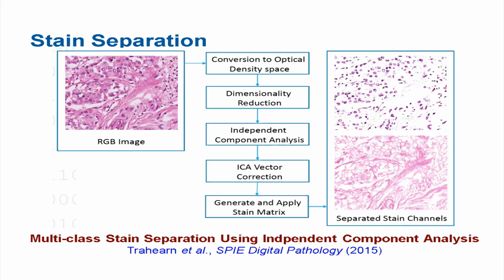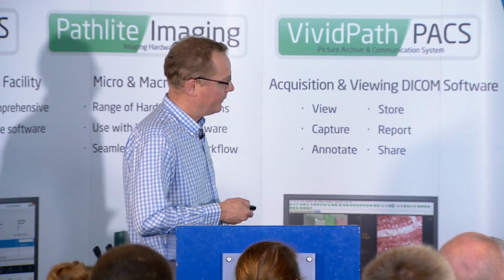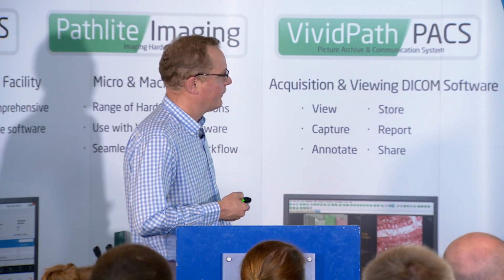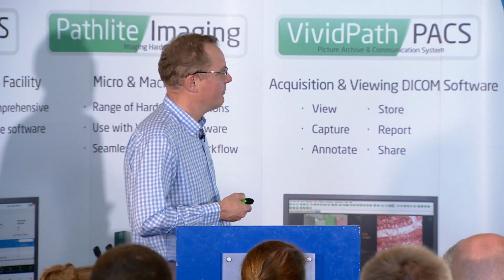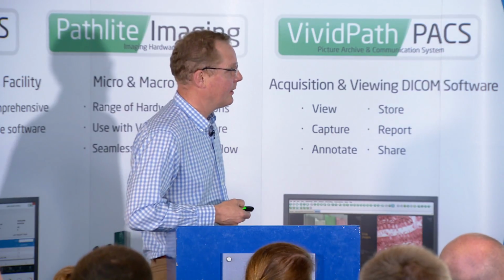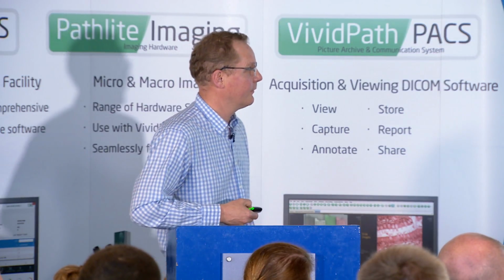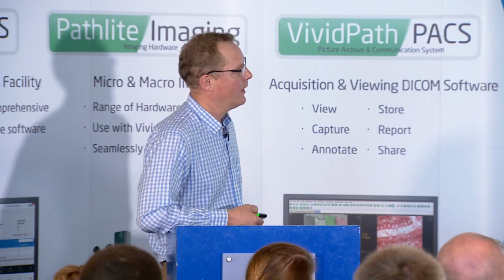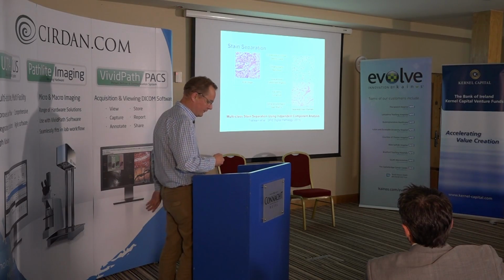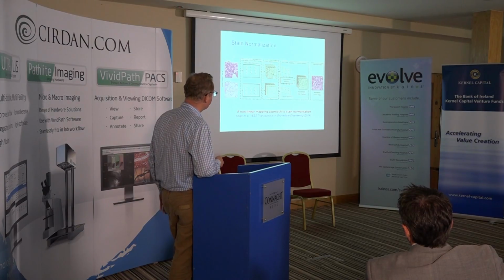And we do this by separating out the various aspects of the stain. In this case, it's an H&E stain. So what we've done here is we've taken one section, that's its H&E stain. We've bleached it. Then we stained it with hematoxylin and scanned it, and then we bleached it again, and then stained it with eosin and scanned the same tissue, same section, stained 3 times over. And so you've got this ground truth of colour separation for the stain that you're using.